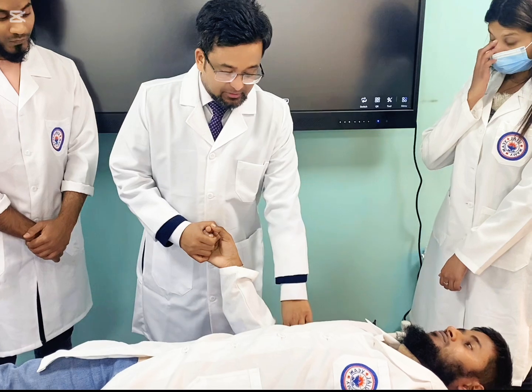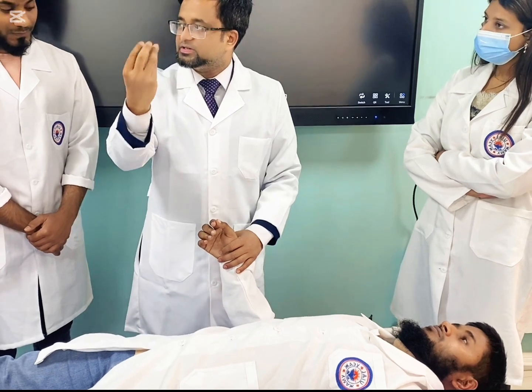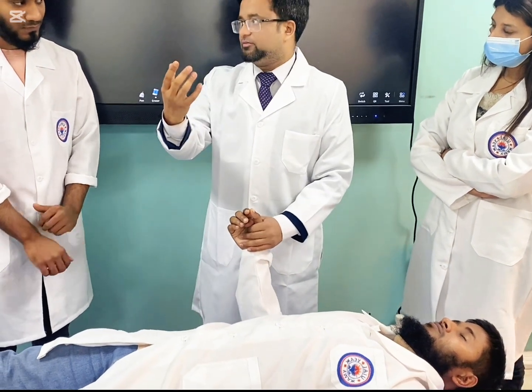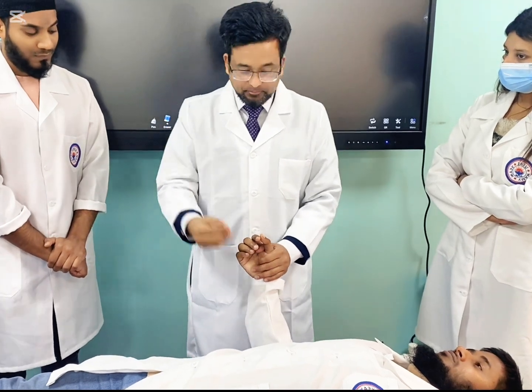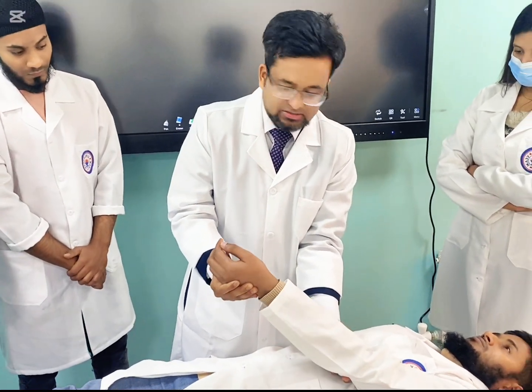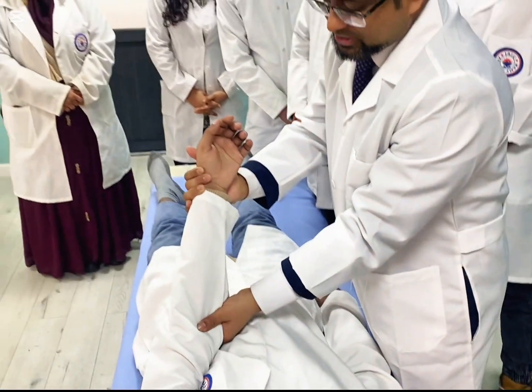For checking blood pressure, you will tie a cuff here and inflate the cuff. When it starts beating, it is systolic pressure. When it disappears, this is diastolic pressure. So how much will you inflate the cuff? We can know how much to inflate. At first, find the artery here. This is the brachial artery, right? So at first, you have to find out the brachial artery.